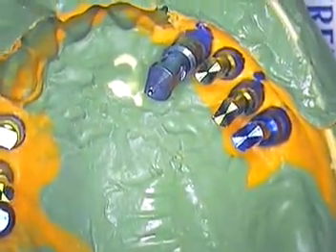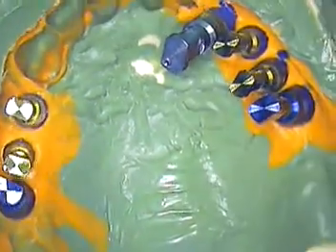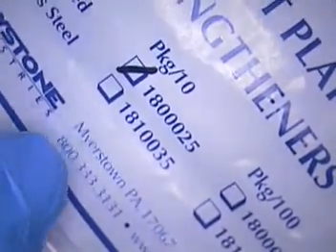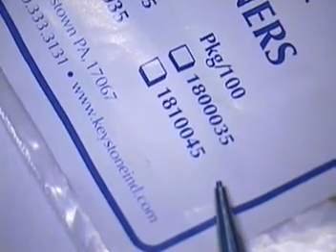As we covered in our last session, this is an open tray impression. The copings were individually customized per implant site. We used a material called a twist plate strengthener by Keystone Industries. There's an 800 number in case you need to find out about that, and the website is www.keystoneind.com.